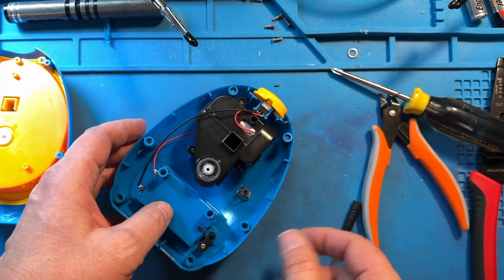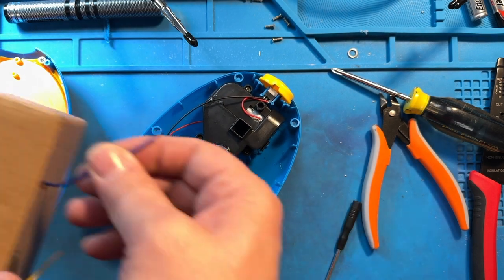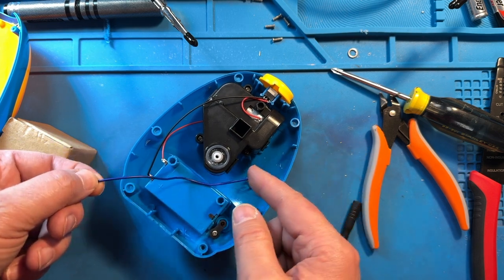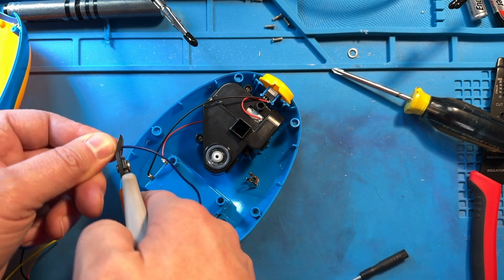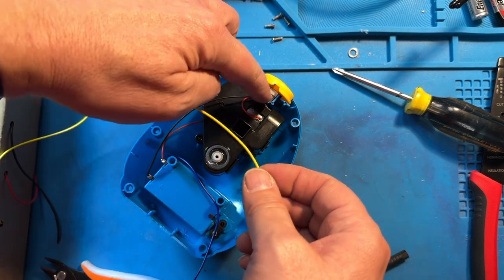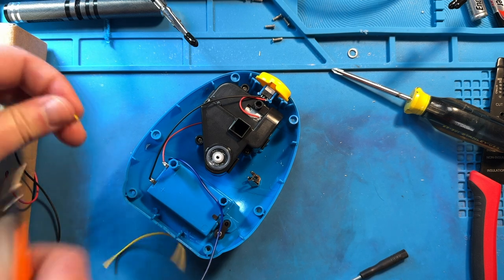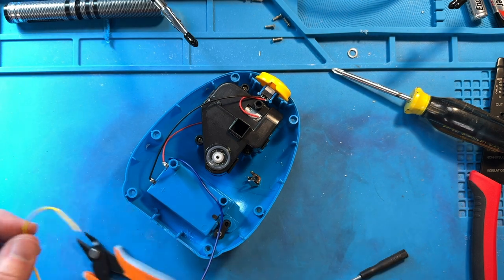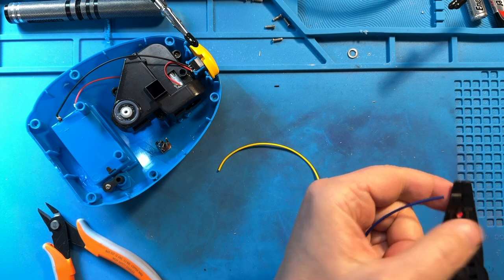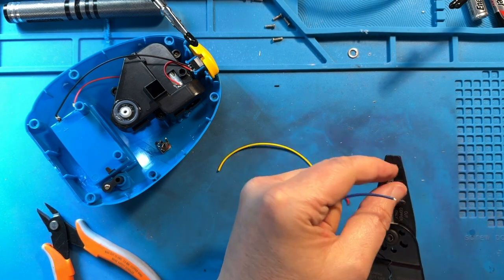Now I need to cut wires that are going to extend from those two spots — one from here to here, and one from here to here. I'm going to get some wire and size it up to the approximate length. A little longer is better than a little shorter. For my other wire, I have to go from that motor down to there — again, just a little longer than I need. I'll go ahead and cut that off. Now I need to strip these wires. This is 22 gauge stranded wire. I prefer stranded wire for this sort of operation because it takes the solder better. I grab my wire strippers, go to the 22 gauge section, and strip a small piece off of each end of each wire.